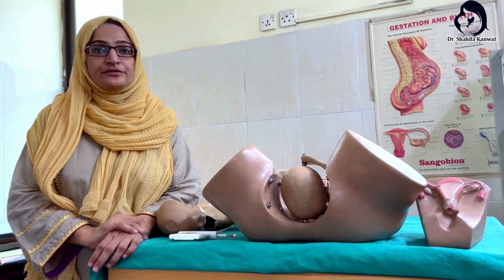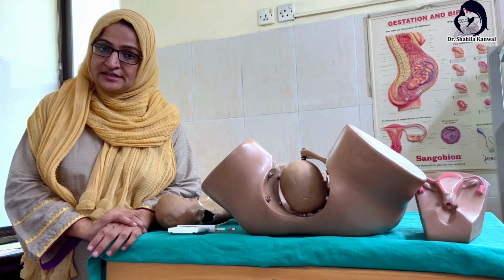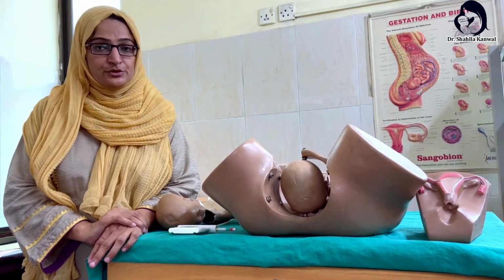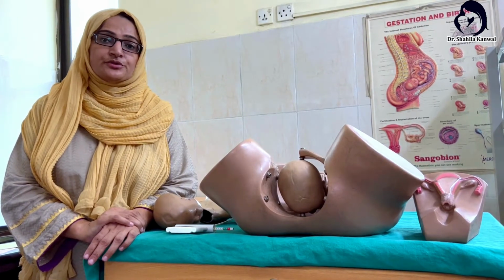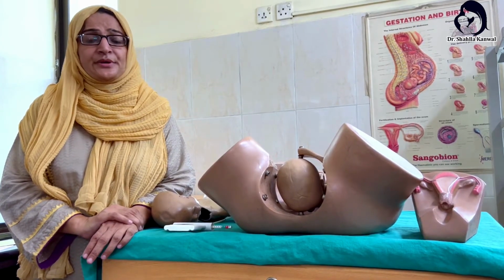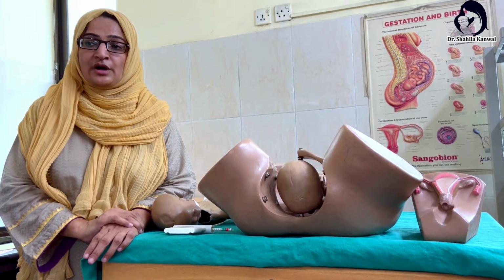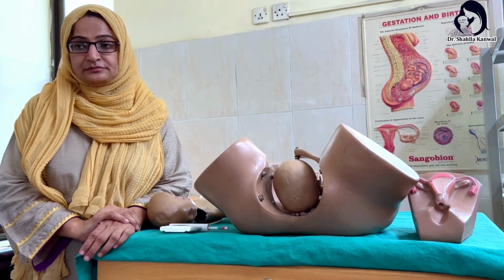The preparation of the patient is you have to explain all the risks and benefits to the patient and take the informed consent. The patient should be in lithotomy position. Bladder should be empty, gowning and gloving before the procedure, and reassure the patient. Make sure of the presence of 2 assistants, 1 pediatrician and anesthetist, as well as assistance for the perineal support.